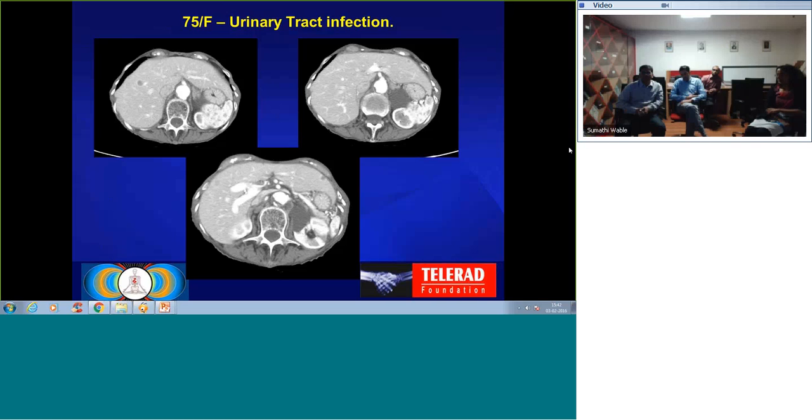I'm not sure why the orthopedic surgeons, who are not very familiar with these lesions, decided to biopsy that. Maybe they were forced to biopsy because if the humeral lesion is not a metastatic lesion, then the patient gets transplanted. I don't recall how big the primary lesion was in the liver.